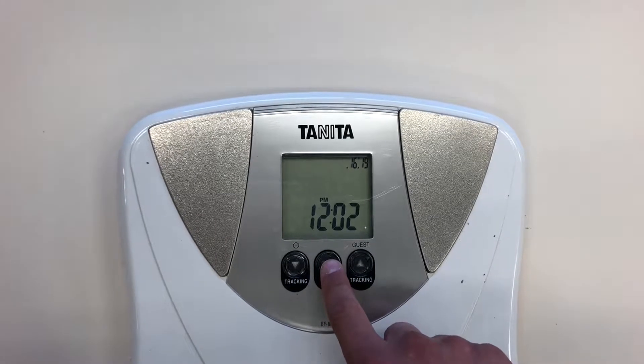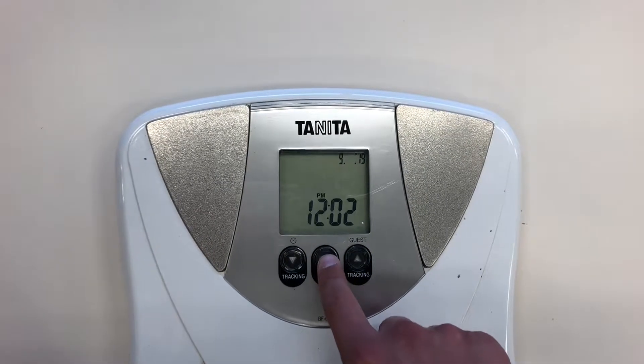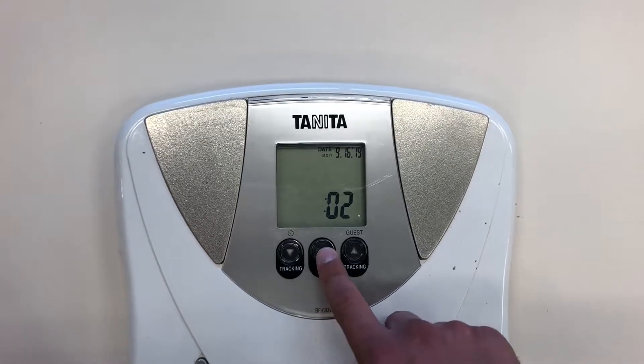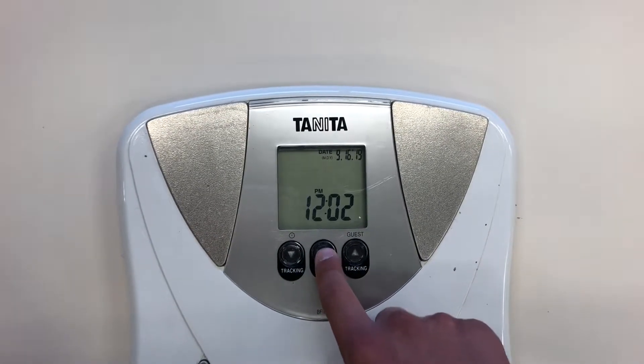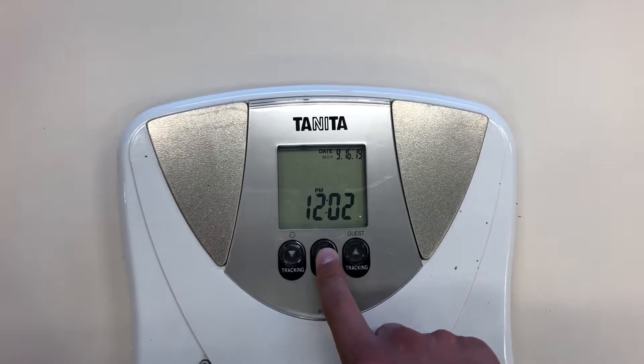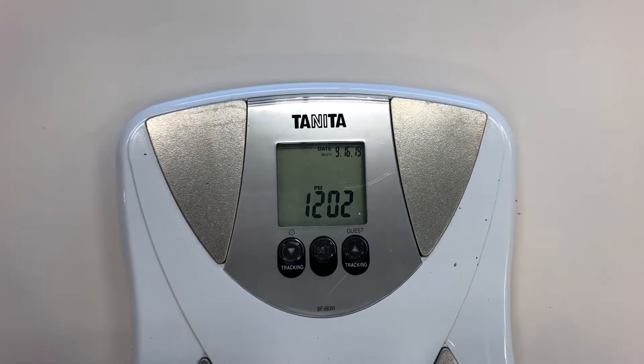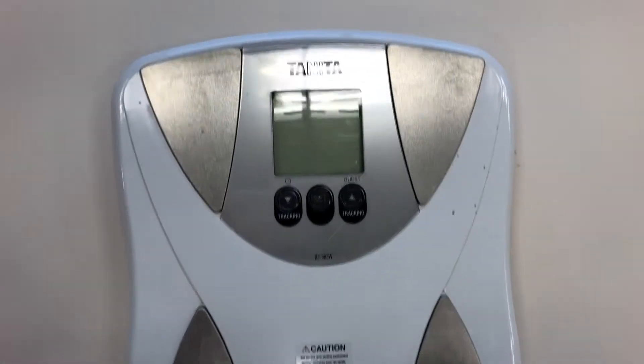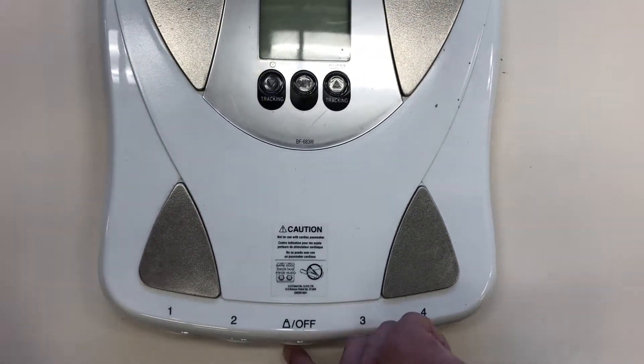Click set, then you can change the month to September, and you can change the date to 16, or whatever the date is that day. We don't need to program the time, so you can just keep pressing set to exit through that system, and then once you've completed that, you're going to click on the off button.